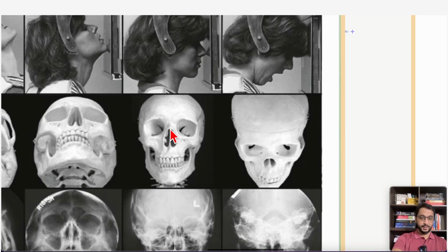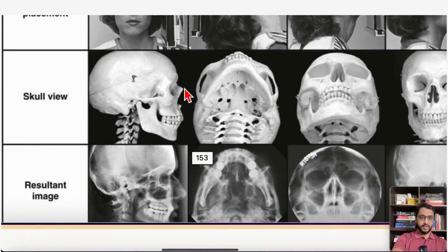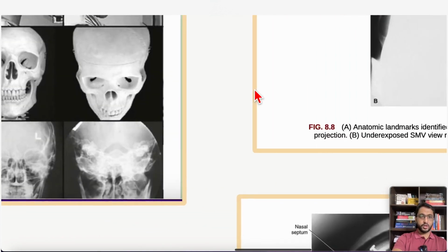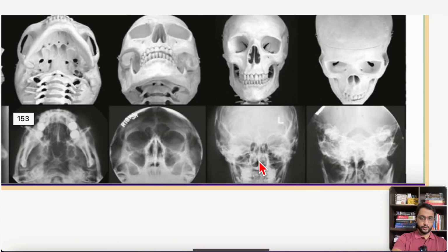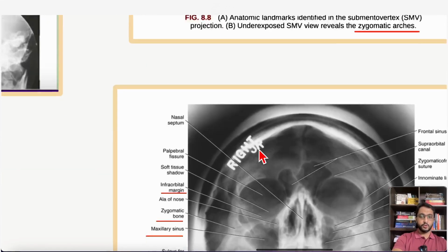Your nasal cavity, whereas if you're looking from the side, very clearly your nasal bone is visible. Okay, so your nasal cavity. Now you'll ask me, why not this? Actually, in a radiographic view, you have superimposition of structures out there. So the better view you get of your nasal cavity doesn't mean the nasal cavity is not visualizable, but majorly PA ceph is for nasal cavity.